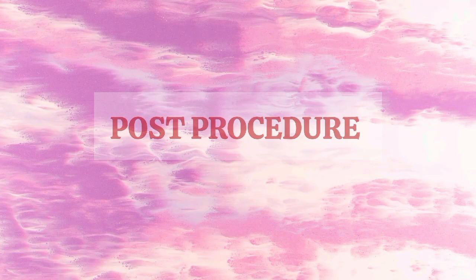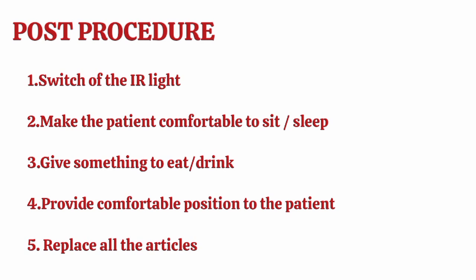Post procedure, switch off the infrared light, then make the patient comfortably sit or lie down and give something to eat or drink. Let the patient be in a comfortable position and replace all the articles as usual.